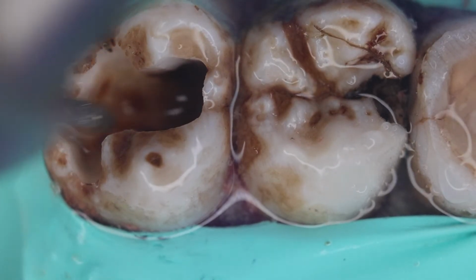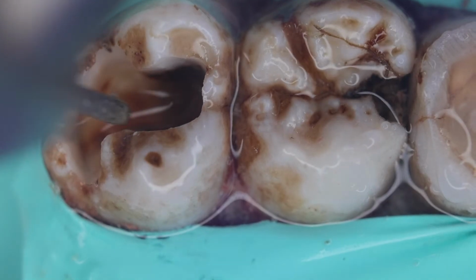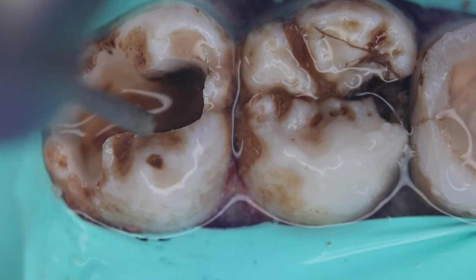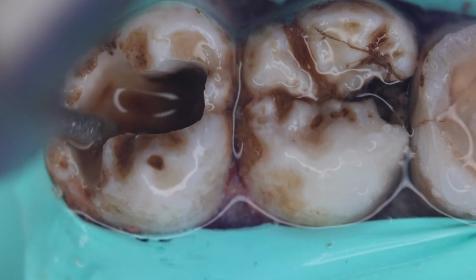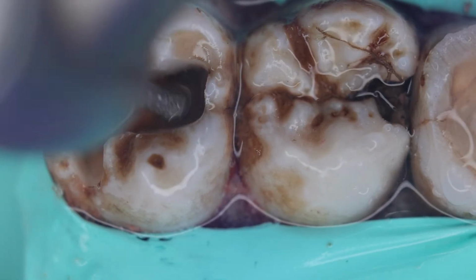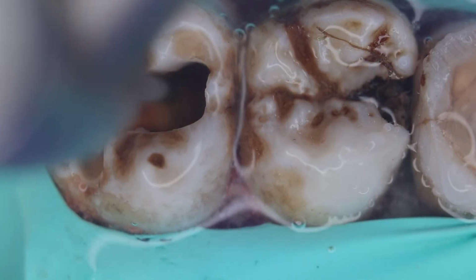See, we have widened the cavity to remove all the caries that is there. This is important, that we should not be just having a conservative cavity where the cavity is narrow. No, we need to remove the carious tooth structure, or the caries that is there.